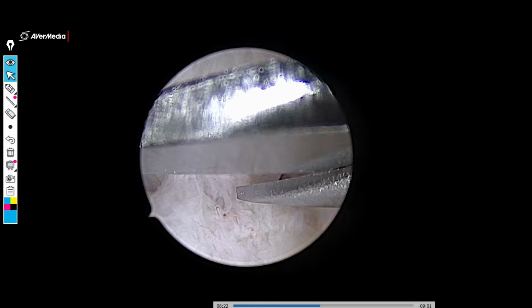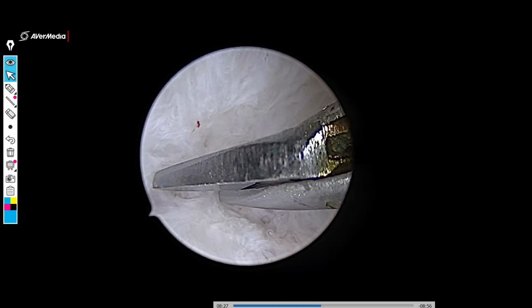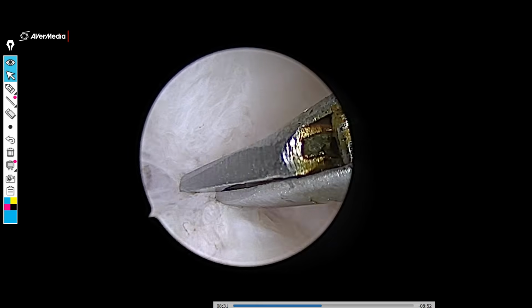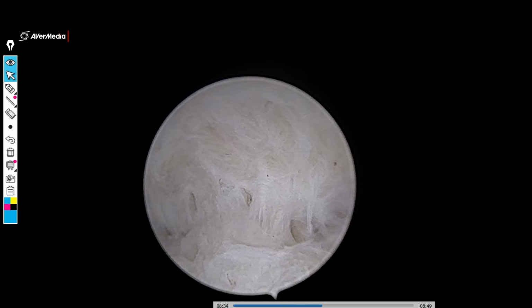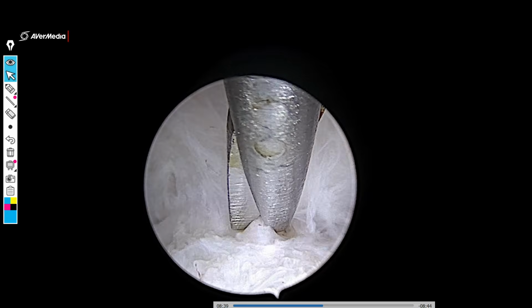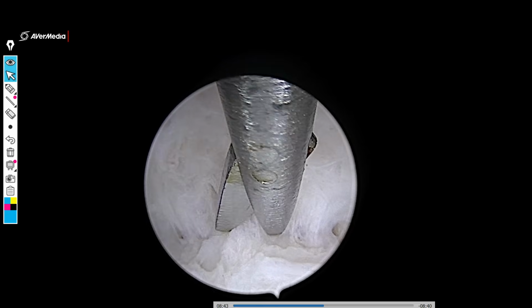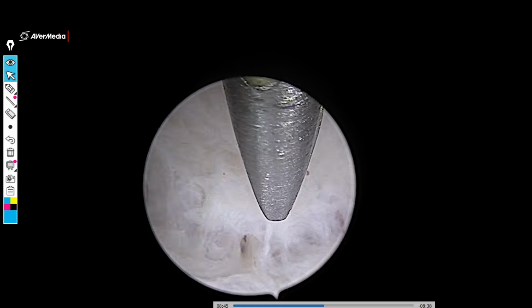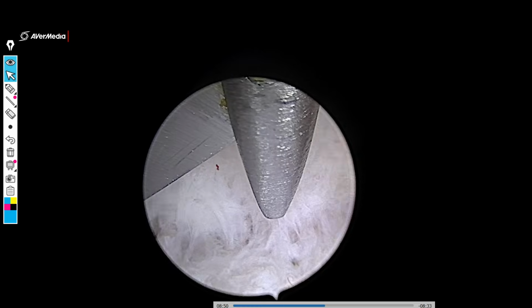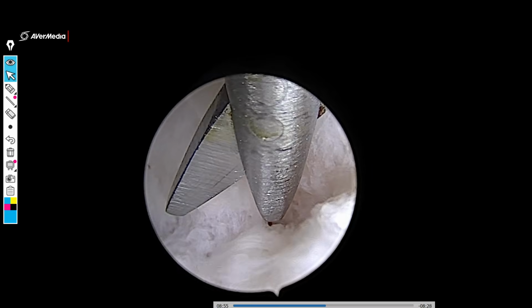That means that if you are able to trim the fundus successfully and you are able to create a near straight line between the ostia on both sides, that also can be considered as an endpoint of surgery. But typically, we prefer to keep a slight indentation in the middle between the two ostia and not make the fundus completely flat. This is because the normal fundus is supposed to be arcuate, and if you make it completely flat, then you are predisposing her to a probable uterine rupture in the future, right?